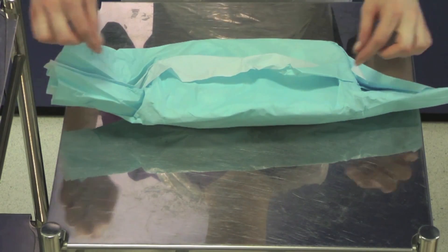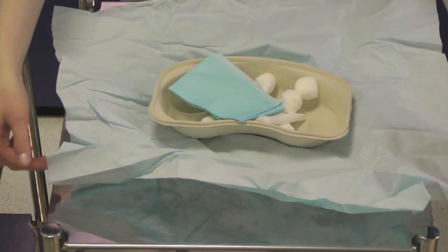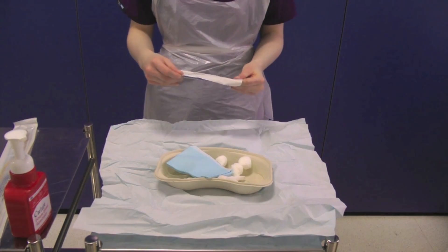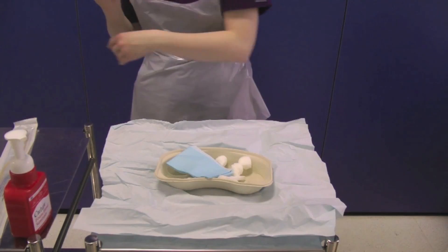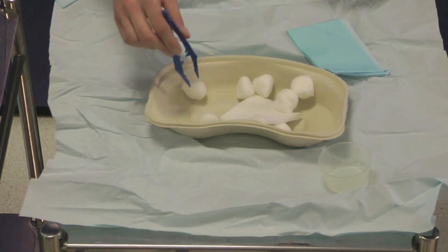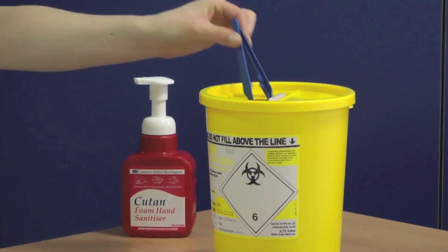Carefully open up the sterile catheter pack, opening the pack away from you first of all. Take your sterile forceps and organise the contents of the catheter pack, placing the cotton wool balls into the sterile pot. Discard the forceps into the sharps bin and decontaminate your hands.